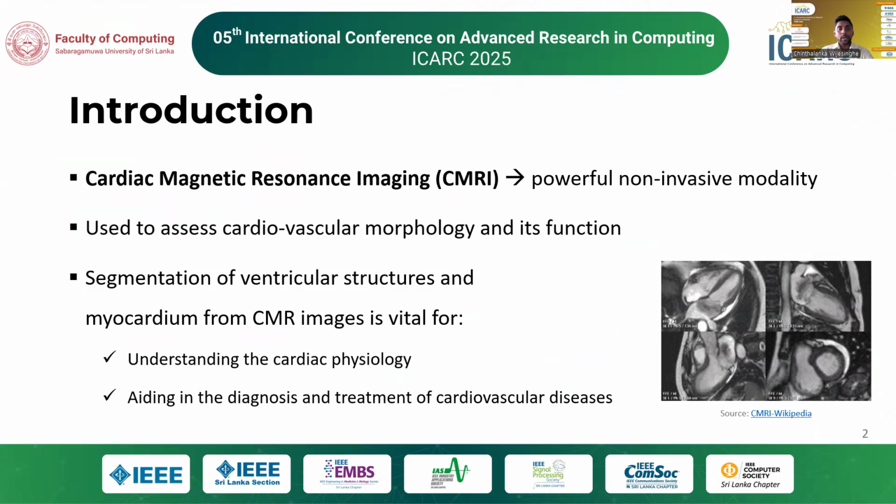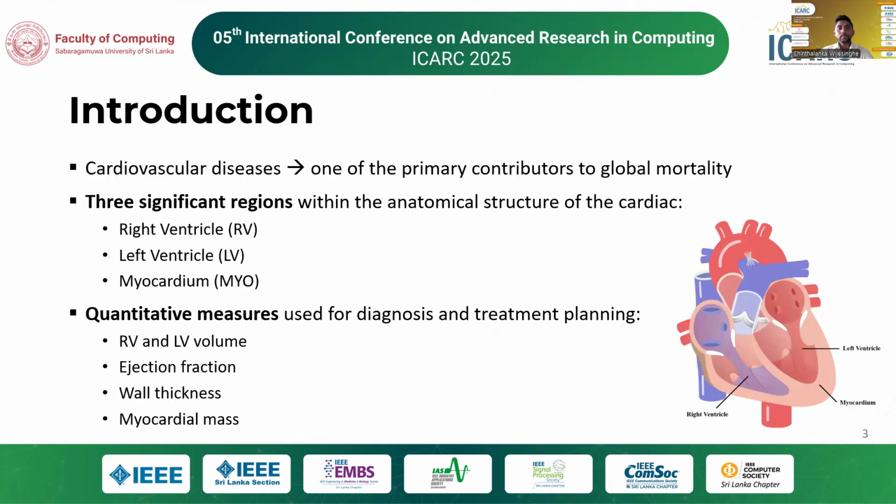Cardiac magnetic resonance imaging has emerged as a powerful non-invasive modality to assess cardiovascular morphology and its function. It is considered the gold standard due to possessing an effective spatial resolution, which is crucial for assessing structures of small size. Segmenting ventricular structures and myocardium from CMR images is vital for understanding cardiac physiology and aiding in the diagnosis and treatment of cardiovascular diseases.